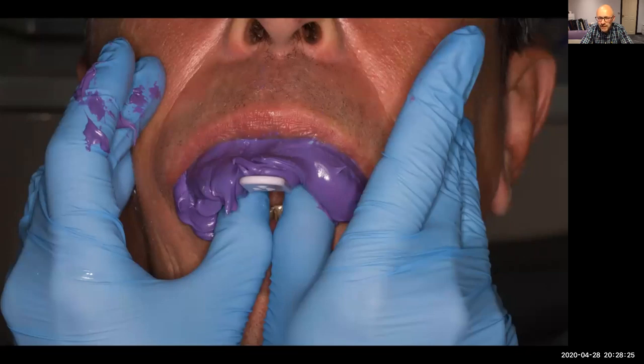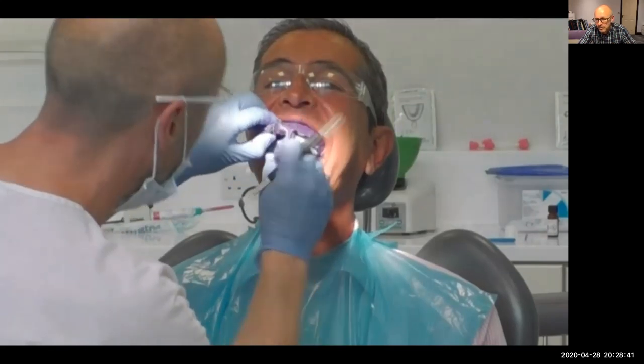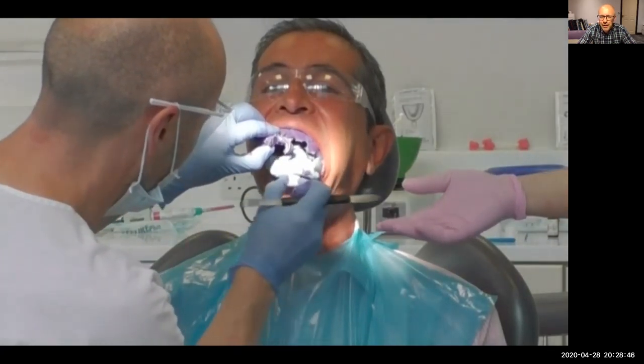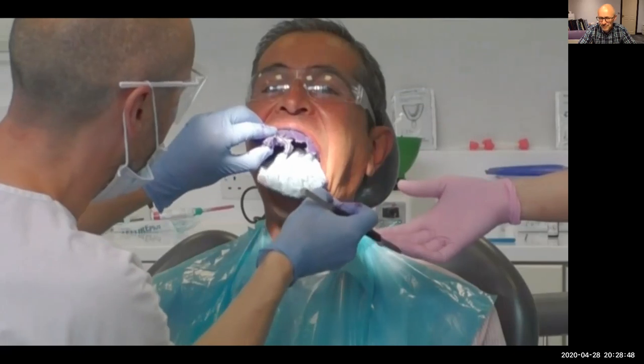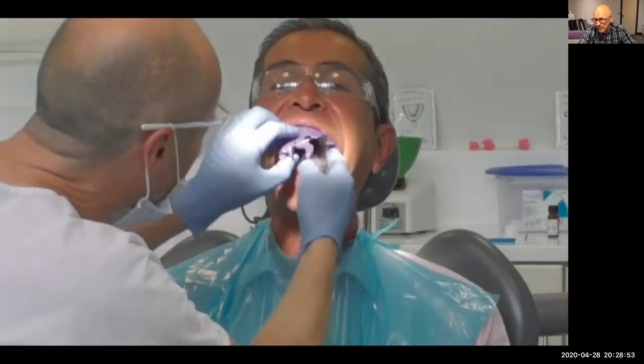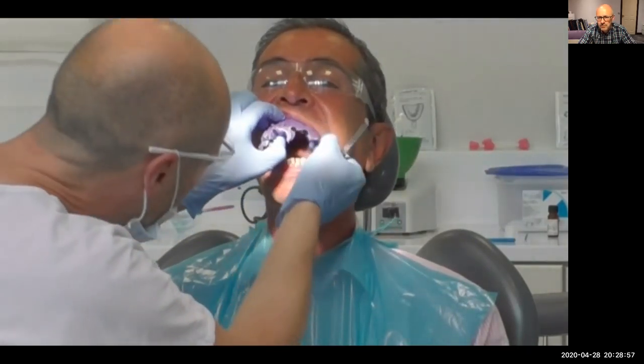So loads of it. And then I massage Joe's lips, so it just feeds beautifully right up into that area. And then I wait for that to set properly. And then I take this out. So I take out the bottom, the underside first. The alginate there, that comes out. There. To clear. And then what I do is carefully take that outside portion.